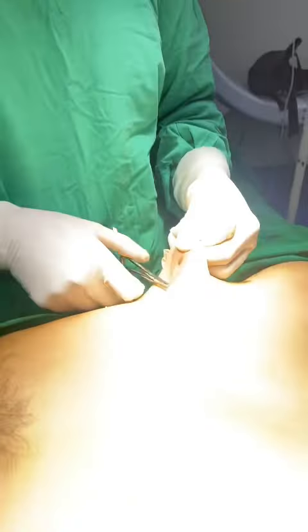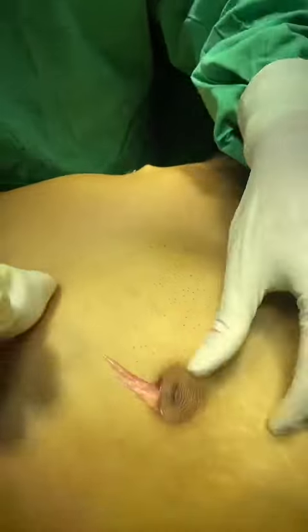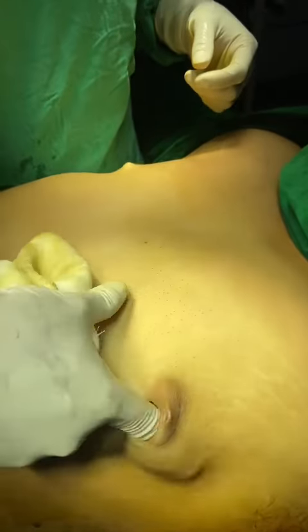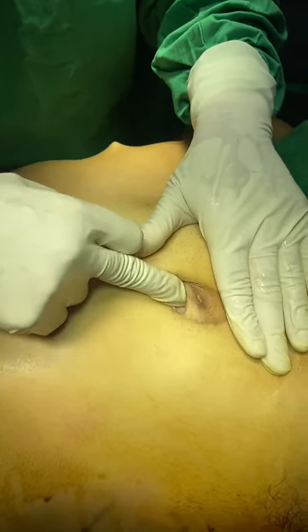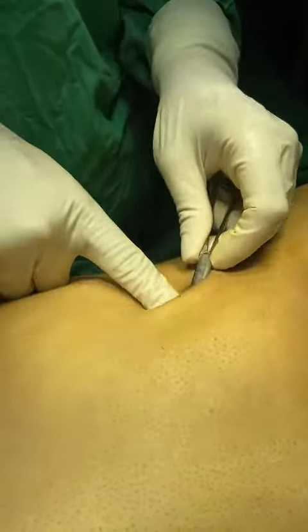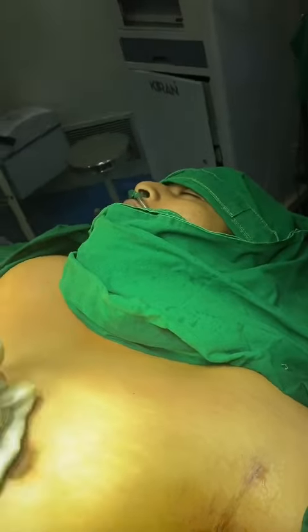Okay, the patient is from Odisha and these are the patient's findings. Complete gland removal done from both sides. You can see this is the chest muscle. This is the chest muscle. This is done under intravenous sedation style.